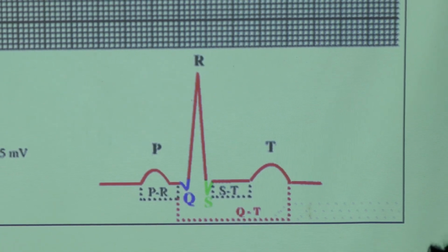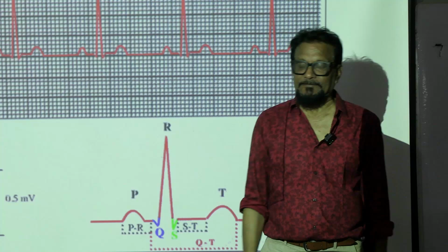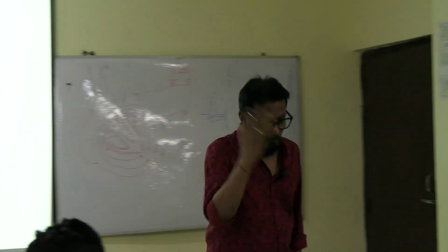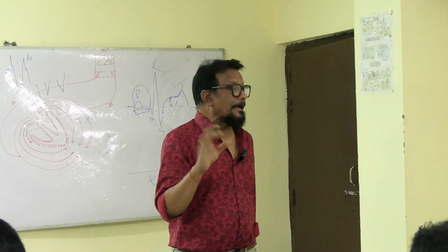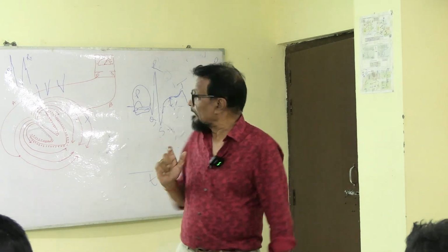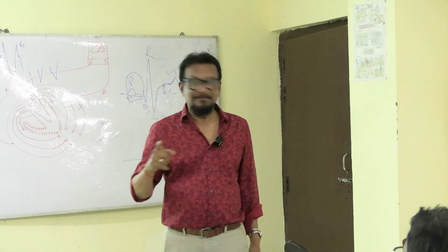Can you tell? Remember, the P wave is represented by the atrium, and it is atrial depolarization.